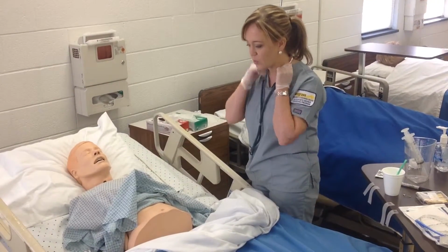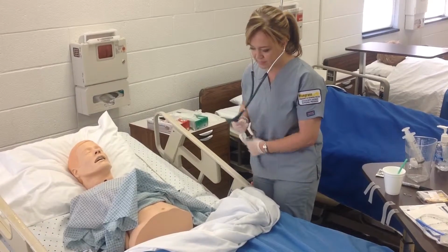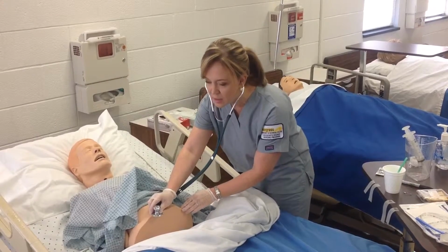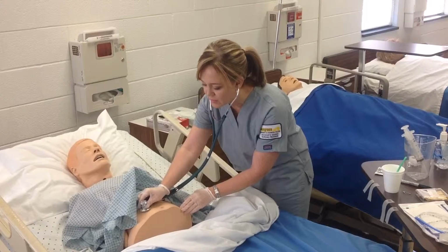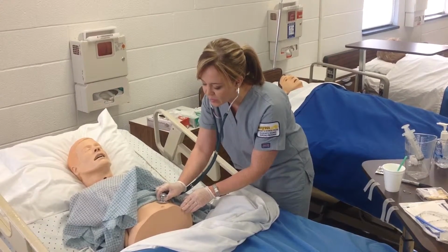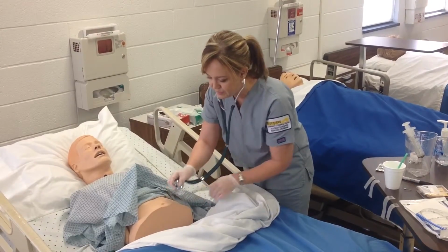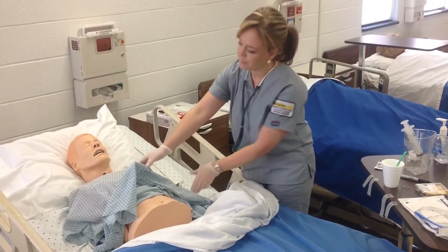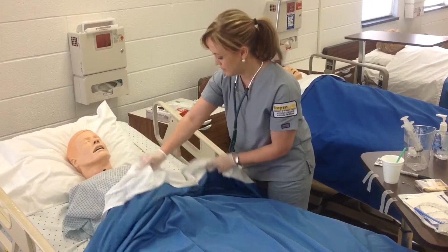I am also going to listen to the abdomen for bowel sounds in all 4 quadrants. I would listen for up to 2 minutes in each section, up to 5 if I'm not hearing anything, and then I would contact the physician if there was an absence of bowel sounds. Okay. Alright. I'm going to prepare you for the procedure.